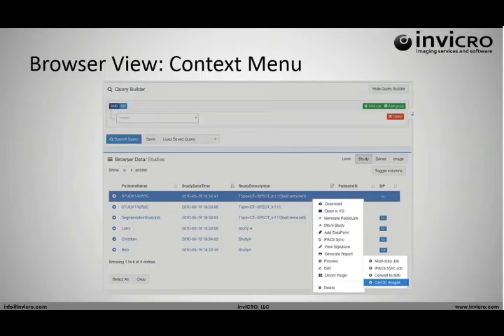So you'd select the data set, right-click, go to do that. If you have custom DICOM scripts or something like that, you can have a wrapper around one of those, right-click, and that plugin would be generated from there. These are configurable and plugin based, so not every iPACS server will have the same processing modules. Here we're looking at iPACS Sync, Convert to Nifty, and a QA/QC thing that we use internally.